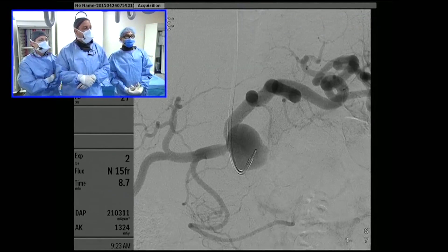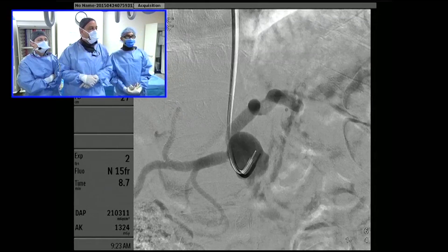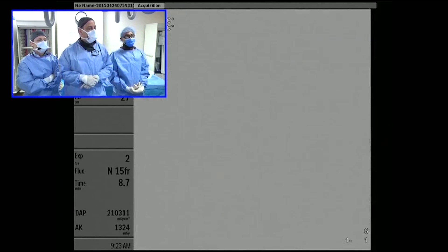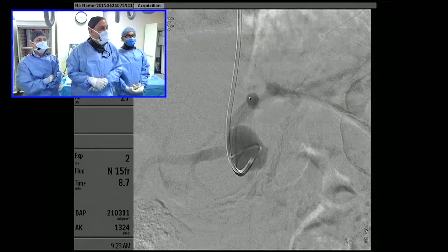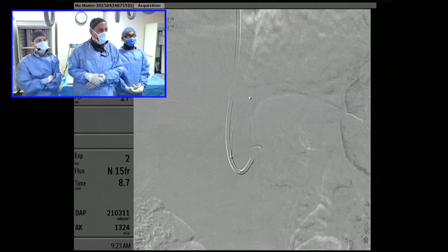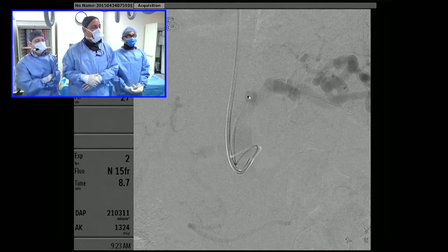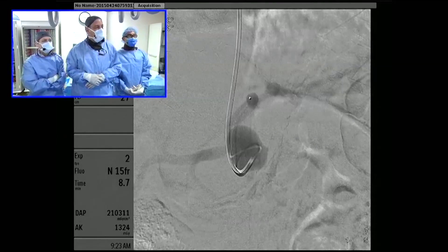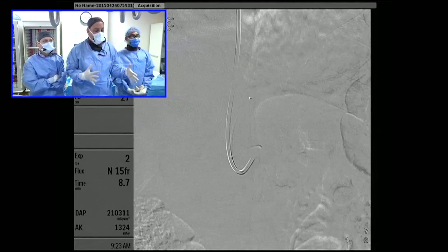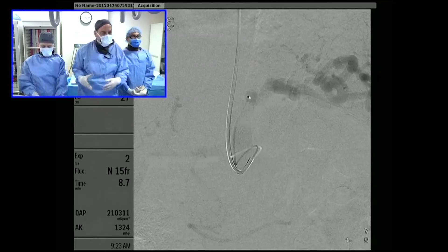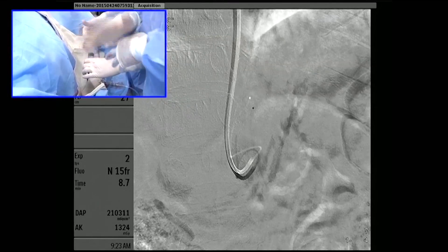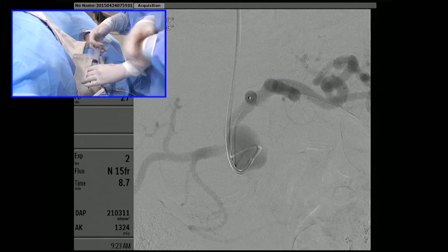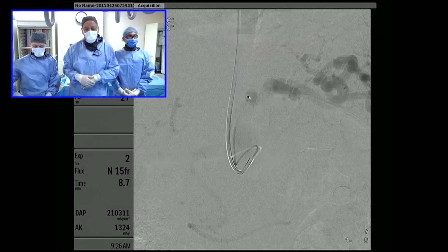Here we've got the JR4 in the celiac aneurysm, and you see the anatomy laid out exactly according to the CT scan. We now have a microcatheter coaxially through the guide into the proximal splenic artery. What we're going to start to do now is deploy detachable coils in the proximal splenic artery — essentially performing an endovascular ligation of the proximal splenic artery.